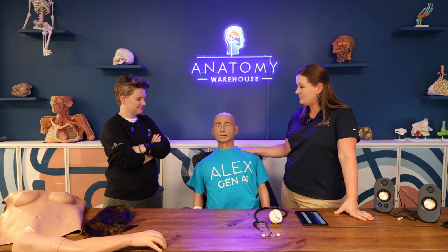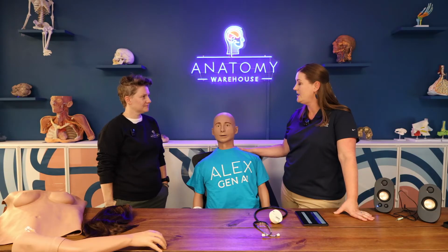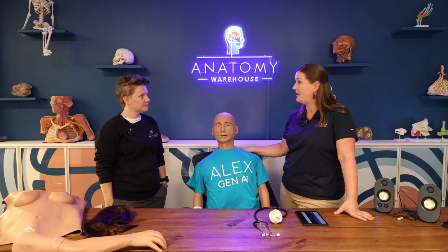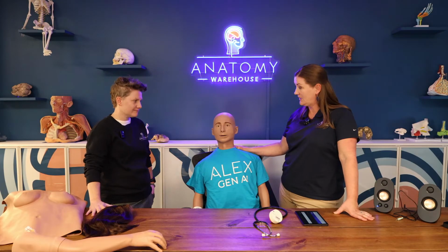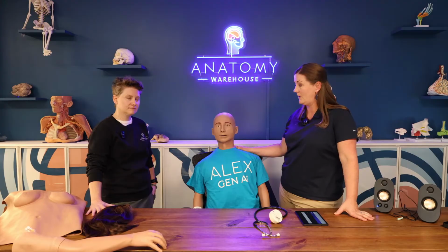The base level mannequin that you see here today is our Alex Gen AI. This is a pro level mannequin, and there are 3 different levels with the Alex Gen AI software. This is our medium skin tone. So Alex is featured in not only the medium skin tone like we see here today, but we also have him in a light skin tone as well.